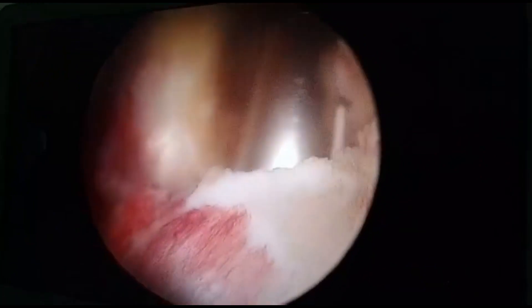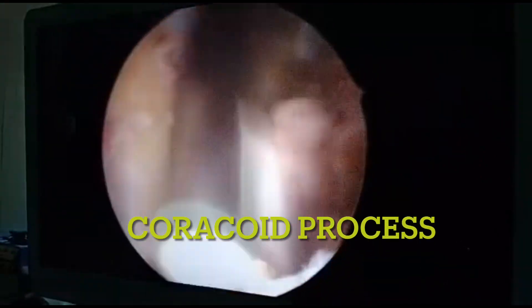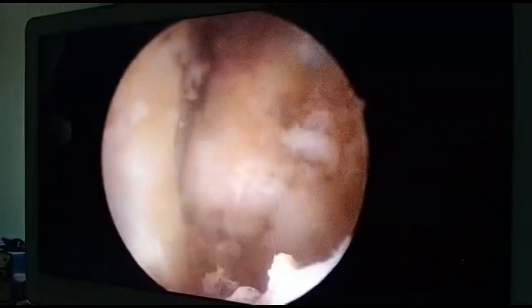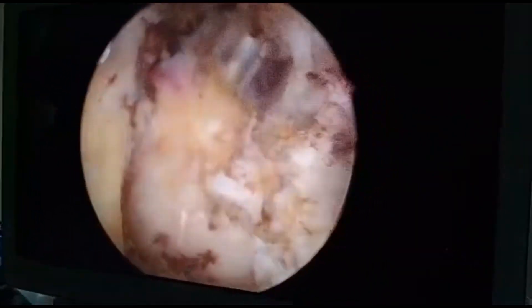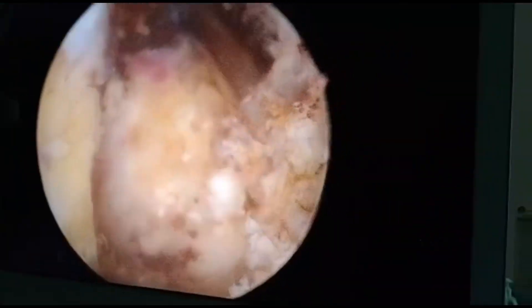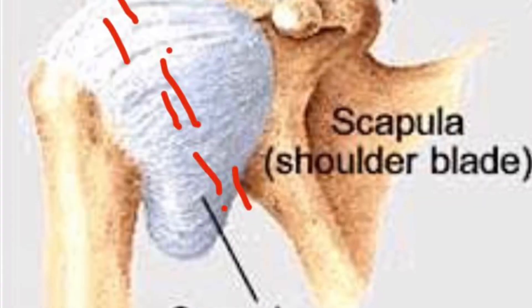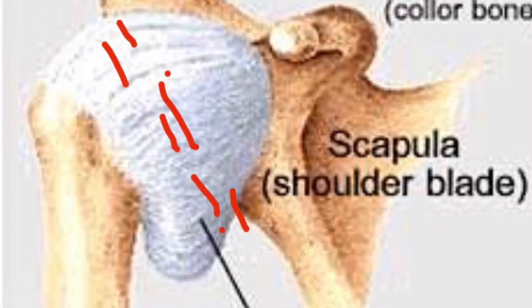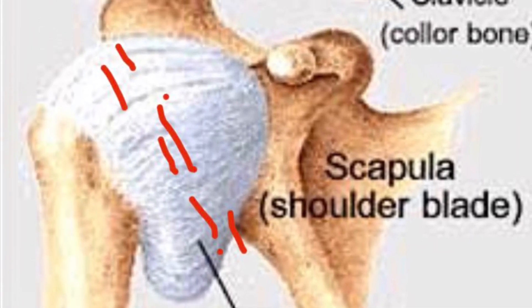We can see one muscle called subscapularis below and another muscle above. This is the step of rotator interval release, and after that we do something called capsular release.